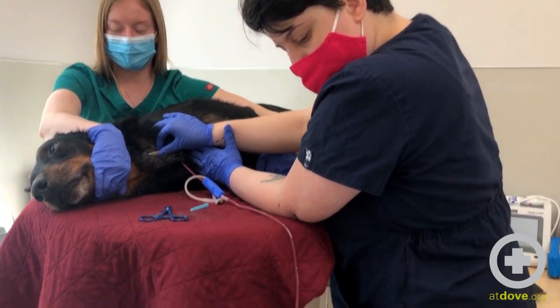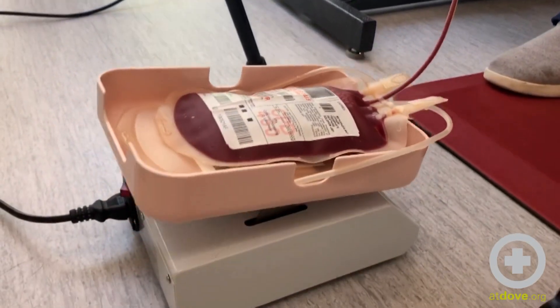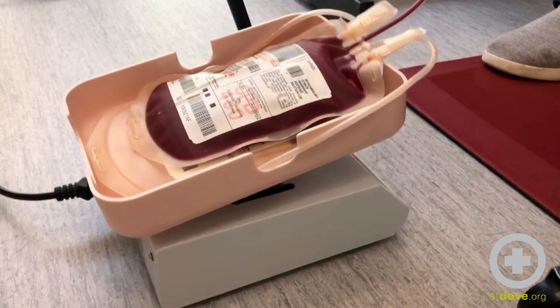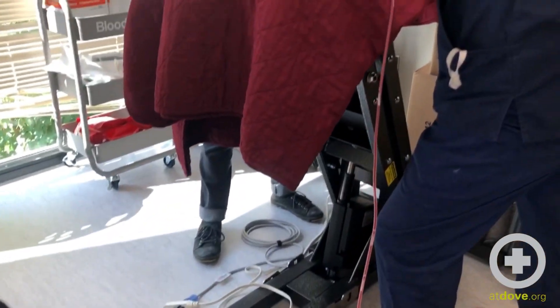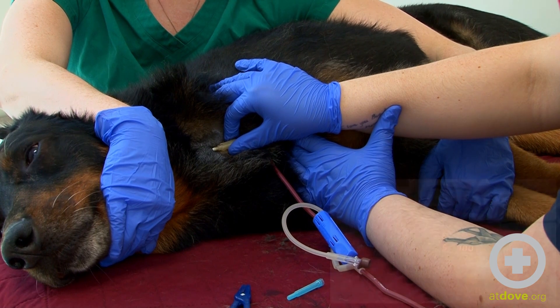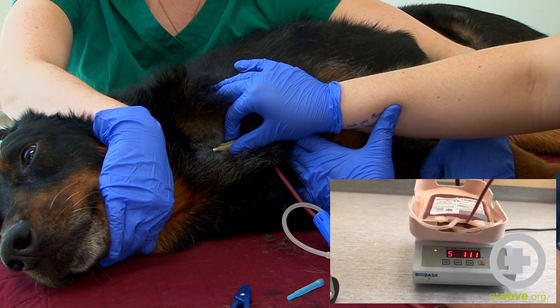We are currently using a rocking scale that's mixing our blood with the anticoagulant. You want to watch the scale rise in numbers so that you know that your blood is still flowing. A typical donation can take about five to ten minutes depending on the dog and their blood pressure as well as their packed cell volume. It should be rising anywhere from one to three grams per second.